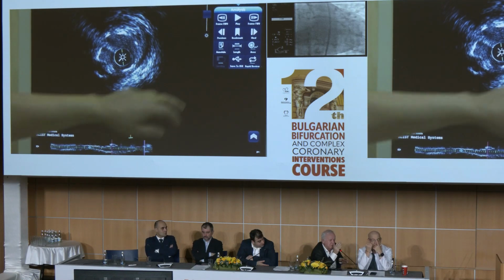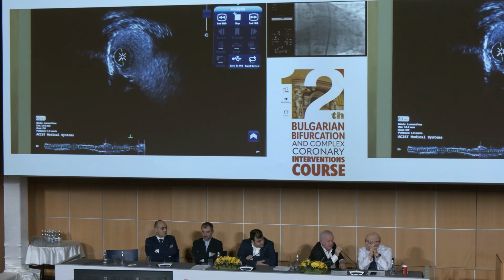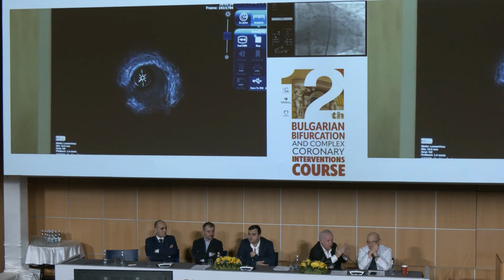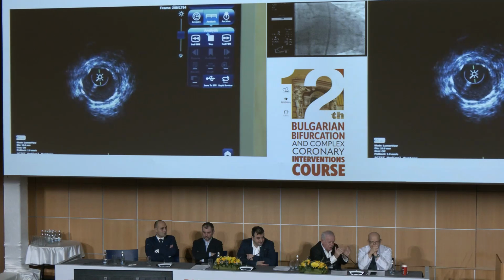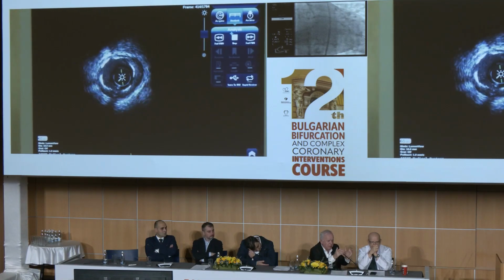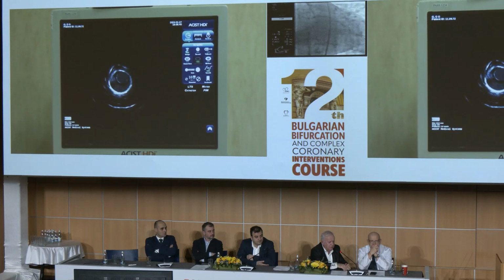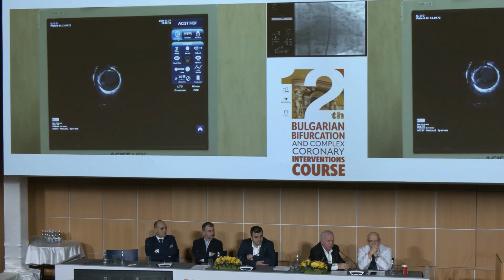My opinion is that what favors the risk of stent thrombosis is not having a homogeneous diameter. If you have a homogeneous diameter crossing an aneurysm, if the diameter is sufficient compared with the proximal and distal wall, I think it will be okay. The risk is, for me, really moderate.